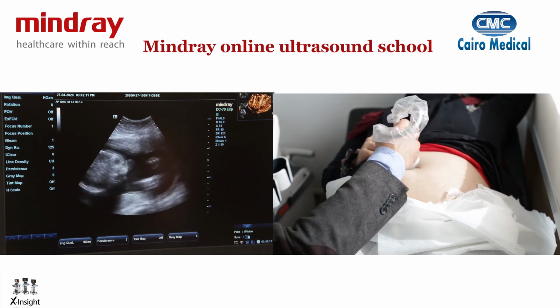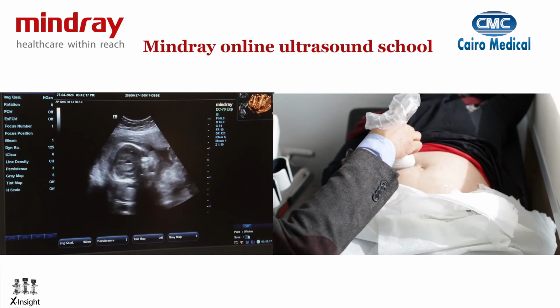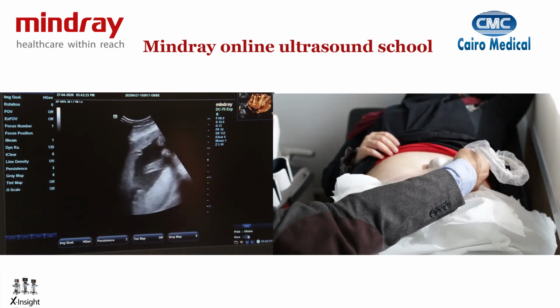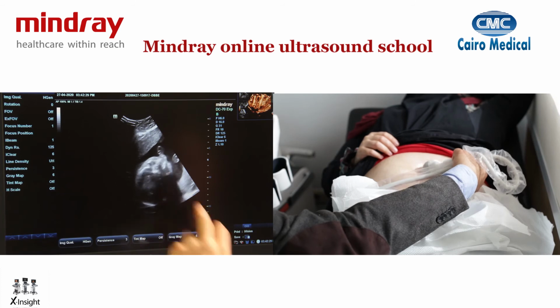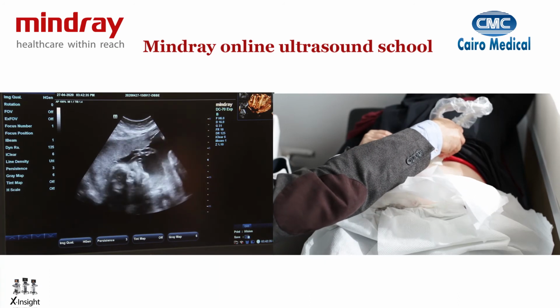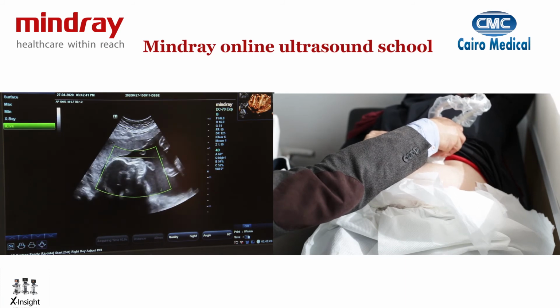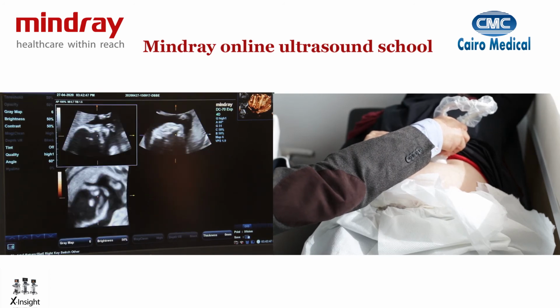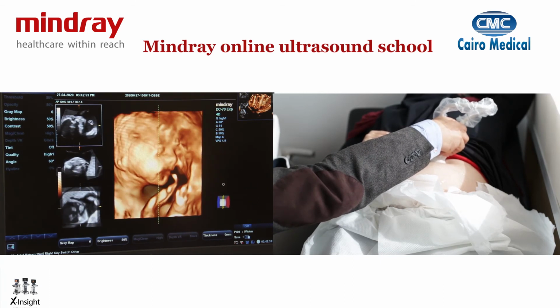Again, if you want to see the face, put your probe longitudinal, see where the midline echo of the brain is, rotate 90 degrees, and then with this midline structure here, move your probe across the whole maternal abdomen to get the midline to face straight upwards, and with that you can see the eyes are facing upwards. If I rotate my probe in that view at a 90 degrees angle to it, then I would see the profile, and I can then apply my window of surface rendering parallel to that, and I can then see a good view of the baby's face.